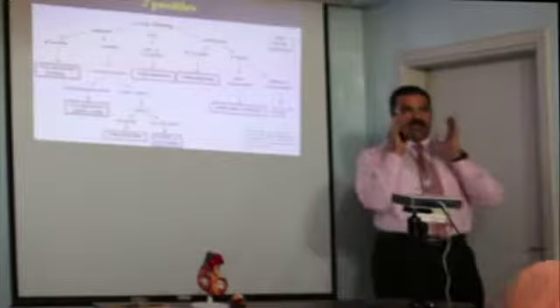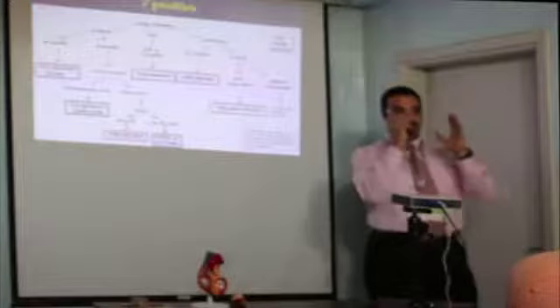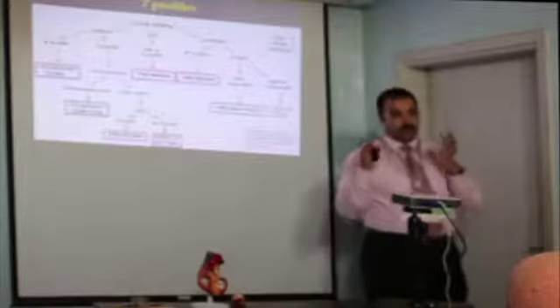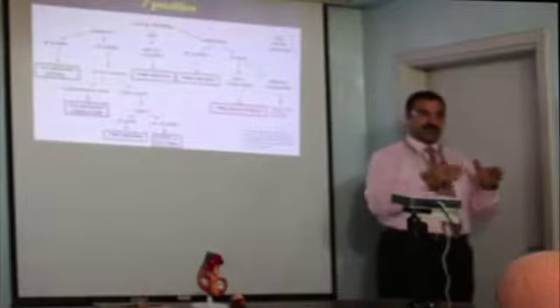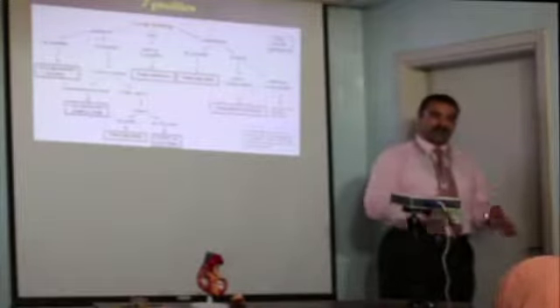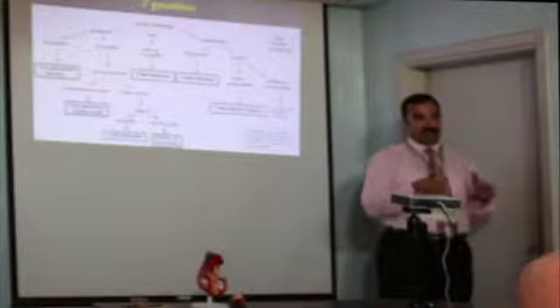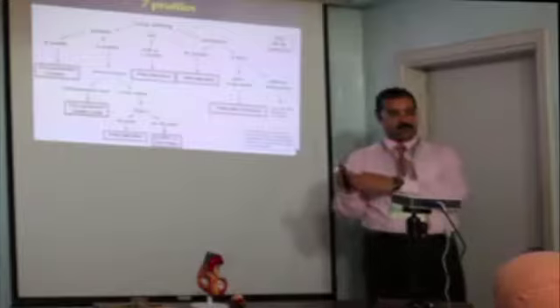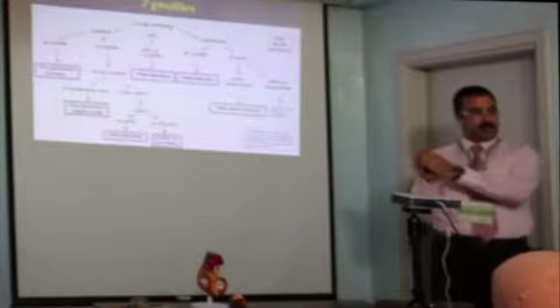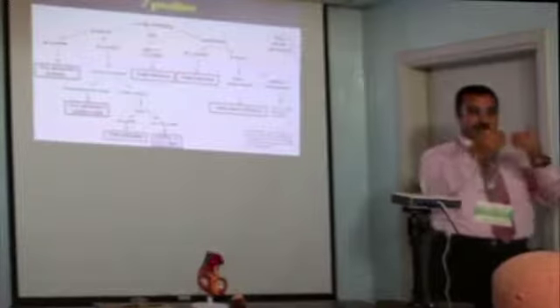So I have an 80% saturation which needs an explanation. If you reach normal A lines bilaterally, the lung tissue is mostly normal. You have to find the diagnosis. DVT mapping, if it is deep vein thrombosis, you diagnose the PE. What to do next? Go and assess RV dilation, tricuspid regurgitation, pulmonary artery pressure, give your management, heparinization or thrombolysis, and reassess. Is the RV dilation improving, is the pulmonary artery pressure improving?